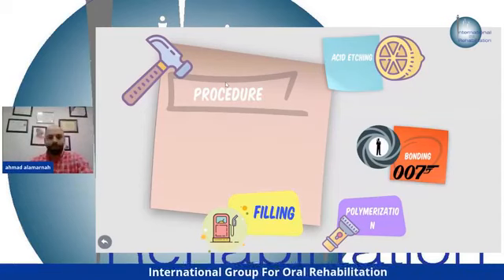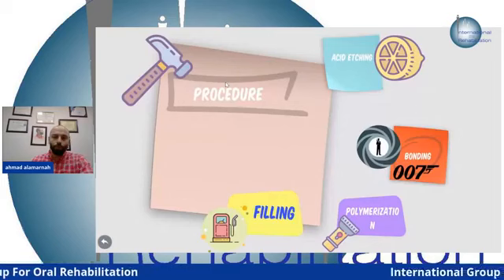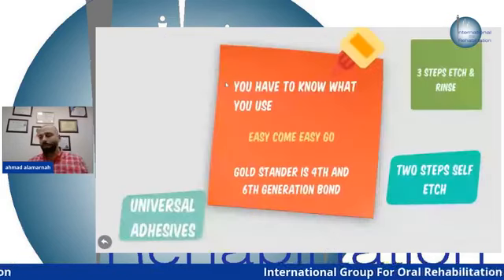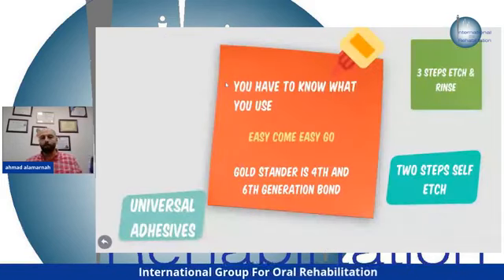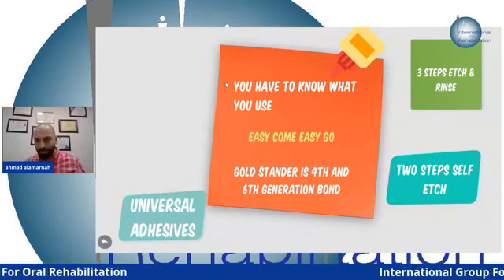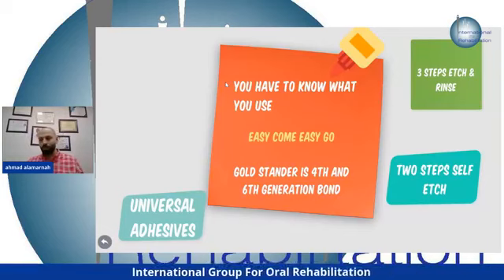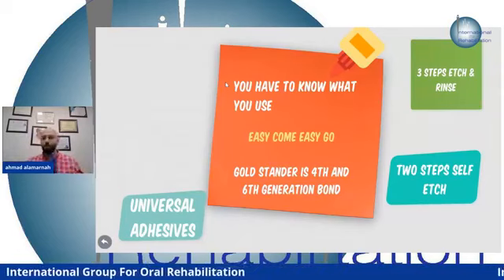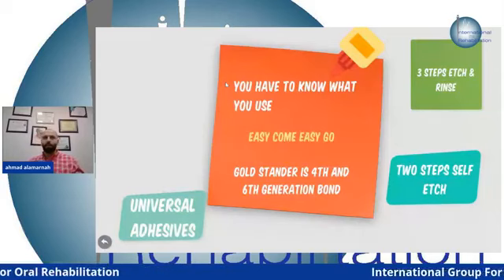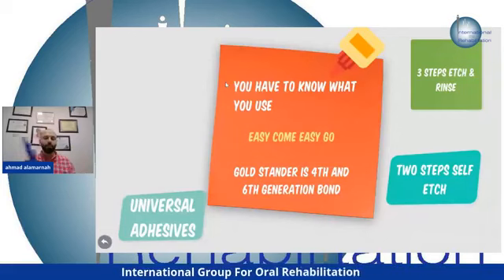Okay. After we finish the acid etching, we have to do the bonding. The bonding, it's like a new world. There are multiple classifications. I chose 3 sections of it because I don't have the time to speak about all of bonding. There's a classification from the first, second, third, fourth, till the 7th generation and the universal.